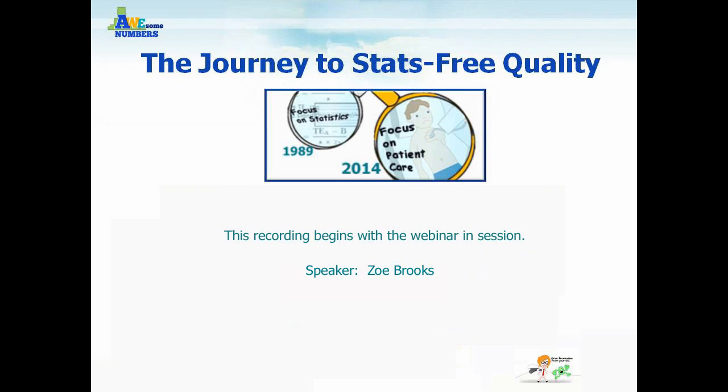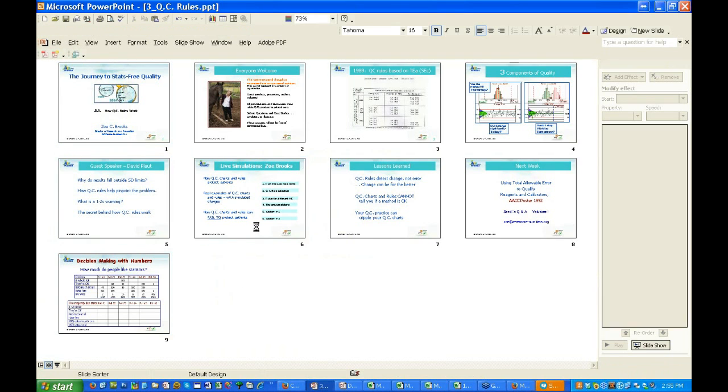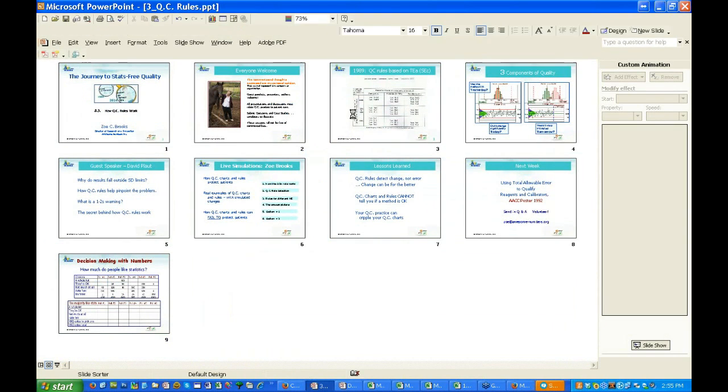What I'm going to do is come back over here and we're going to do some live simulations. Now there's a few things that I agree totally with David. There's a few things that I'm going to question, believe it or not. And one of those is going to come back to here.